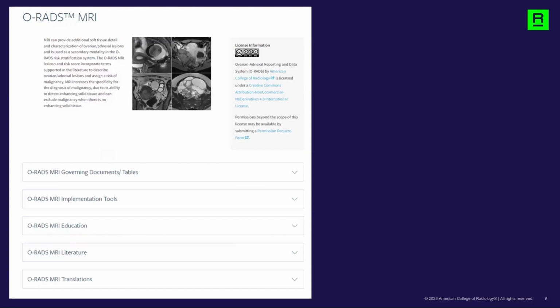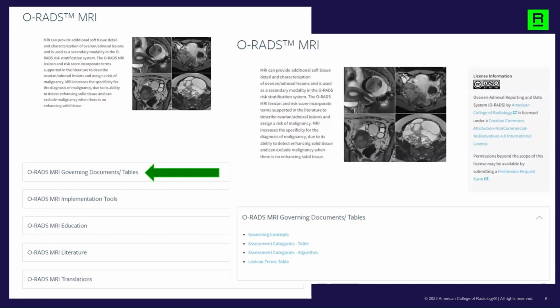If you click on the MRI image, it will take you to this next screen. Each of these subheadings on the bottom half of the page contain hyperlinks to additional helpful material. For example, there are documents that provide MR technical guidance, O-Rads MRI template samples, and there is a link to the ACR O-Rads e-learning module. If you click on the first subheading, the governing documents and tables, you will find some of the more frequently used documents, including the O-Rads MRI assessment categories table and lexicon terms table. The term ACR uses for risk stratification is assessment categories, so you'll find the scoring system there.